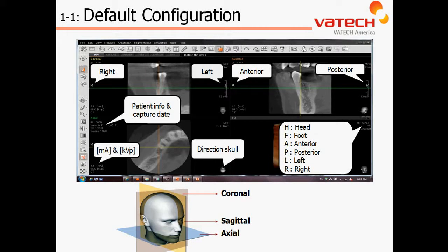In Chapter 1, Section 1, the default configuration will define our views such as our anatomical markers for right and left, anterior-posterior, identifying patient information and capture date, exposure settings, anatomical orientation as it relates to our view, as well as anatomical orientation options in our 3D window.